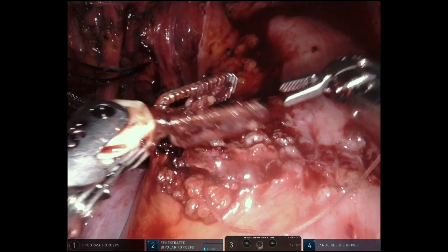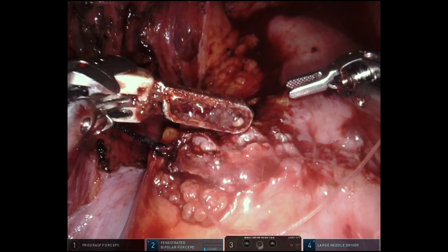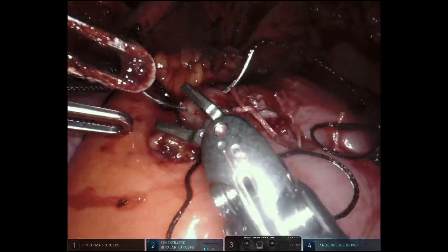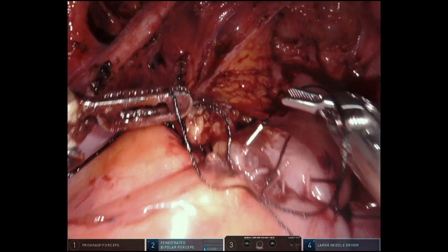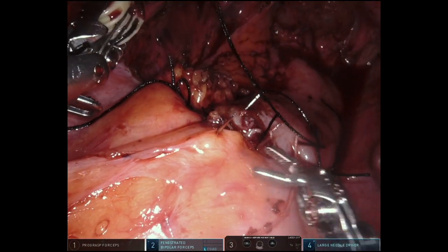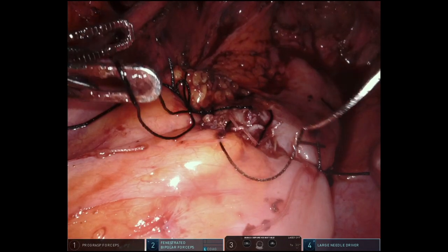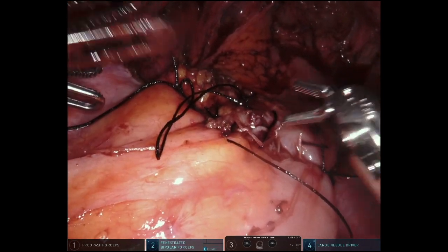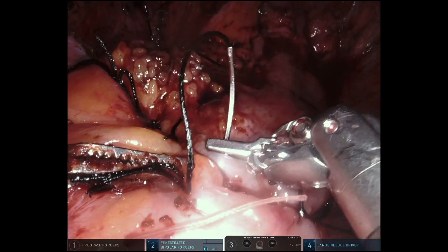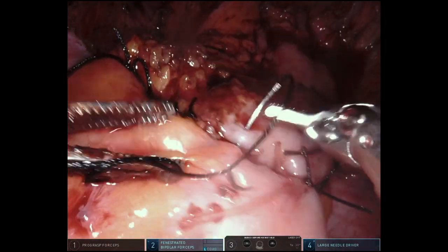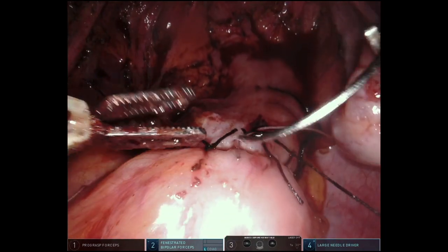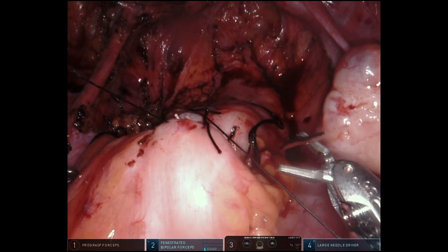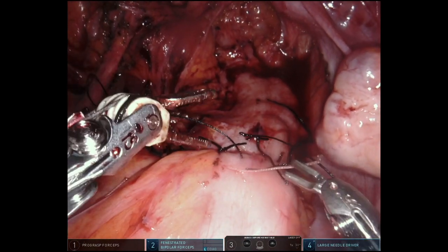Here we see the completed first layer of the closure. We now begin to create a second layer of imbricating sutures, this time using interrupted 2-0 silk. Each imbricating suture includes bowel serosa and muscularis on both sides of the incision, pulling tissue over the previous closure of mucosa and muscularis. With the final sutures being placed, one starts to see what looks like a fairly normal piece of bowel with healthy serosa to healthy serosa and a wide open lumen.